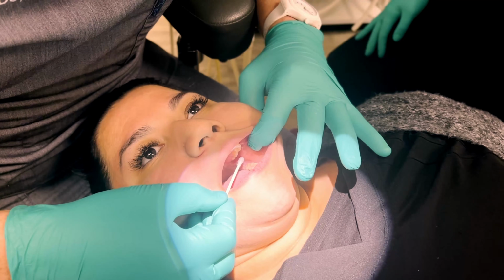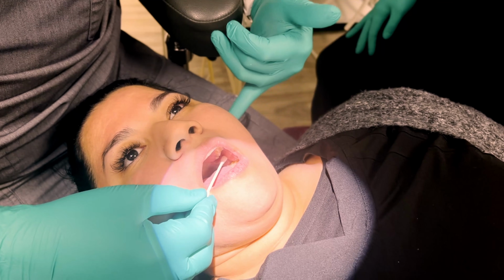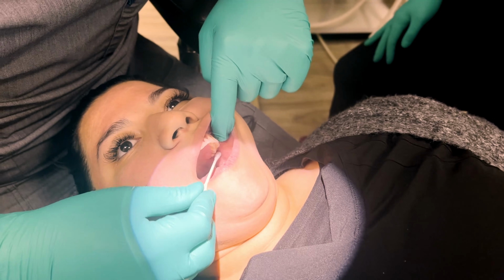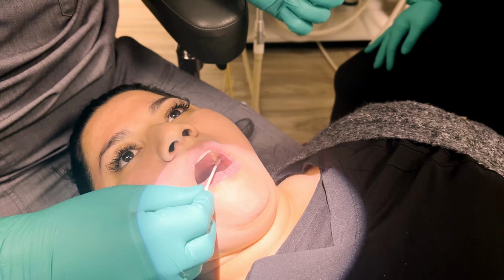So your IA, you're going to be coming in right around here, and you'll see the angulation is angled kind of right up in this area. For the Gow Gates, you actually have to go all the way up here, so your angulation is going to be higher, and you're going to come in almost by where the second maxillary molar goes in, and go the full length up to where, kind of close to where the condyle is.